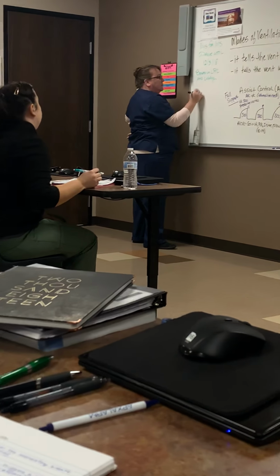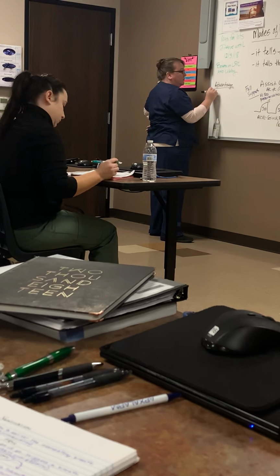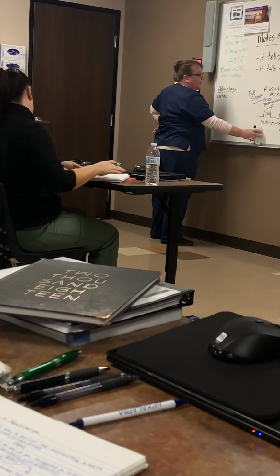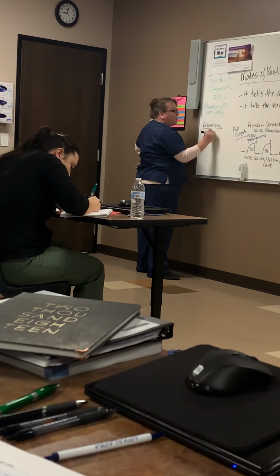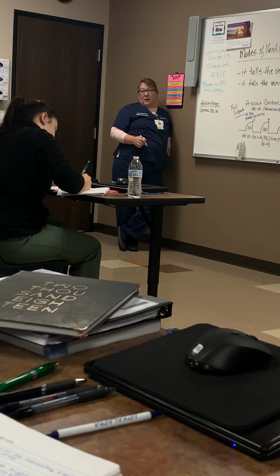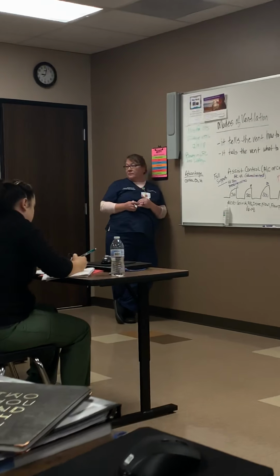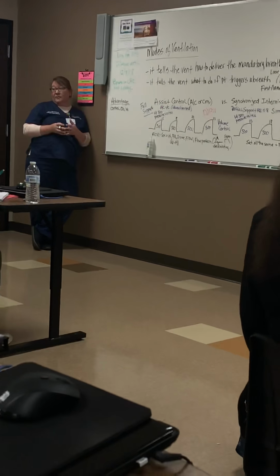What's an advantage, do you think? You can control minute volume and CO2. This is an advantage of AC VC or SIMV, either one of the modes we're talking about right now. Control CO2 and minute ventilation. Remember, it's VE. Because we can control the volume, we have much better control of CO2 and minute ventilation. Like a COPDer we want to get to his target CO2, which is much higher than what we're used to, this is the best way to do it.